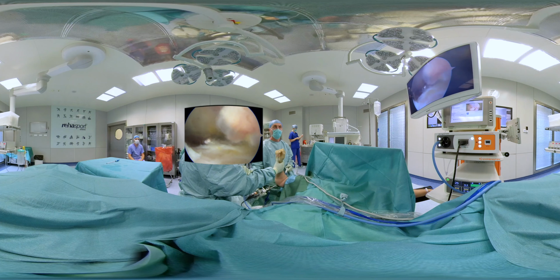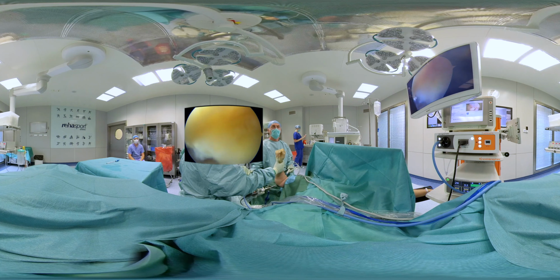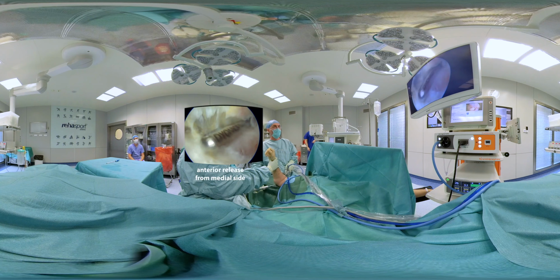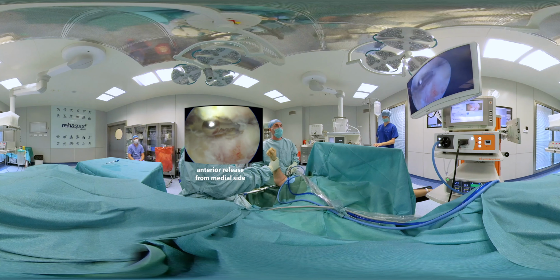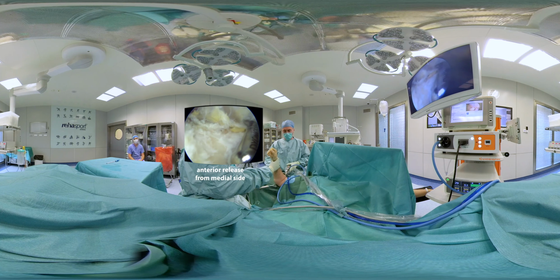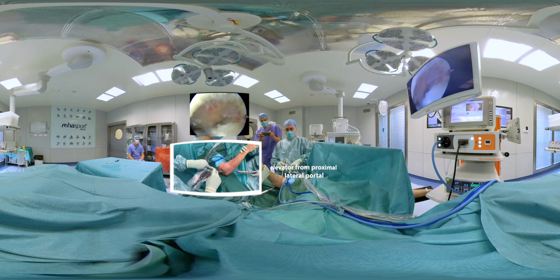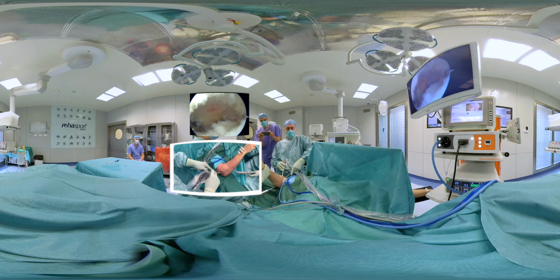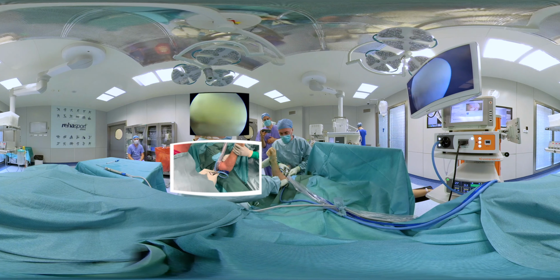Anterior capsule is released first laterally from humeral attachment, then medially. Tissue elevator can be inserted from proximal lateral portal to expose anterior medial capsule and continue release.